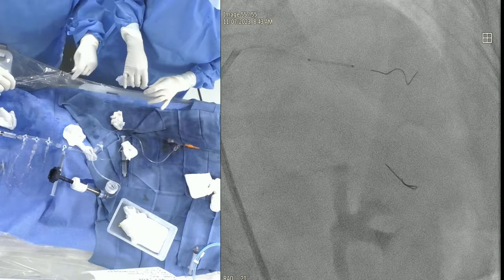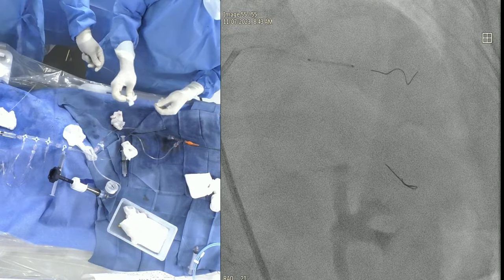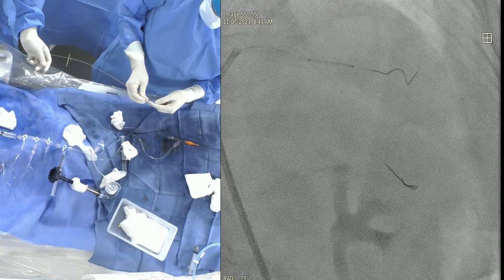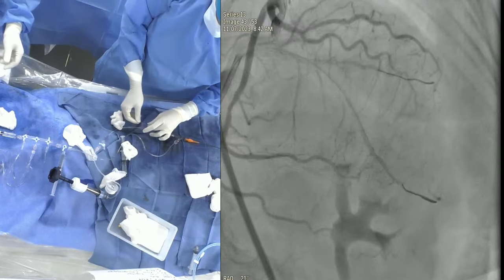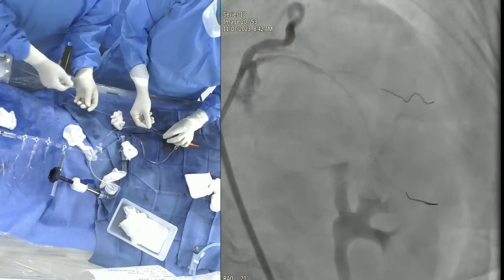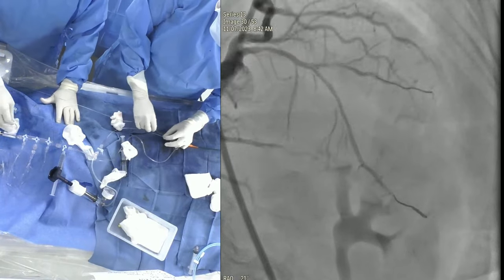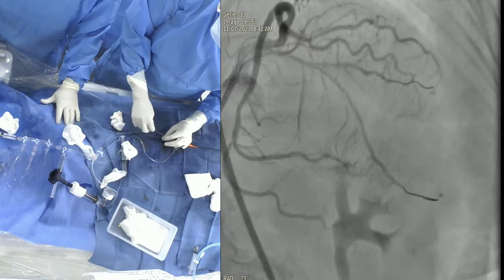And I think we can take our vote from the audience: do they think the proximal LAD lesion is significant? And they can look at this angiogram. Yeah. Angio means the lumen, the MLA, will be less than 4 mm². Proximal. I bet it will be.